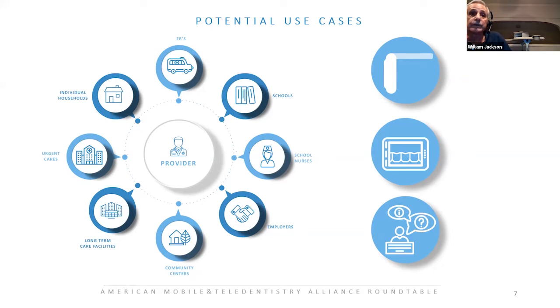It can be at senior homes, it can be at community centers, long-term care facilities, nurses that are going into homes, nurses that are going into care centers. Once again, very simple for them to use. If we ask them, as we had it in our past, to use an intraoral camera, it's just not going to work. And we could go on and on.